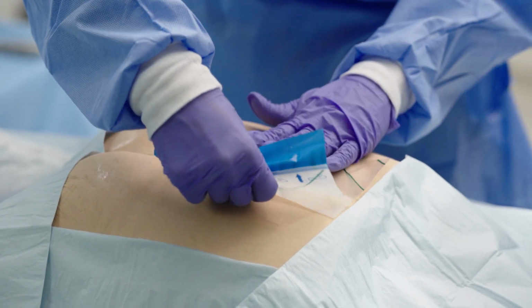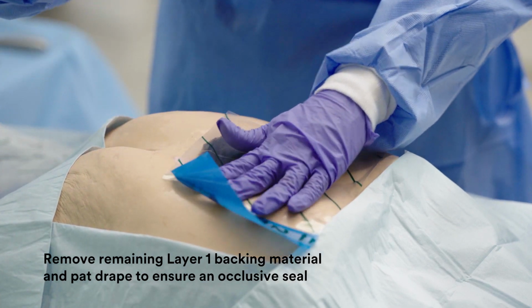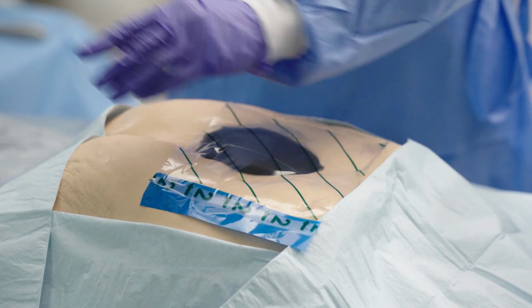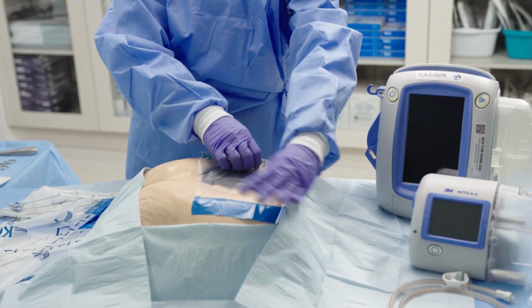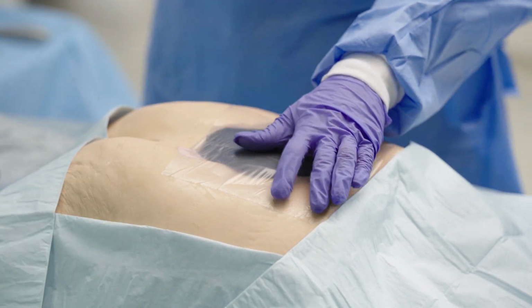Place the adhesive face down over the foam and apply drape to cover the foam and intact skin, ensuring it covers at least a 3 to 5 cm border of intact para-wound tissue. Remove green striped stabilization layer 2. Remove perforated blue handling tabs from drape.